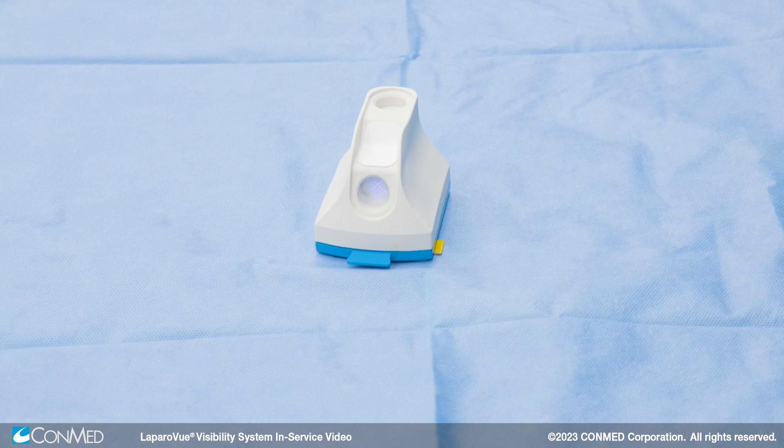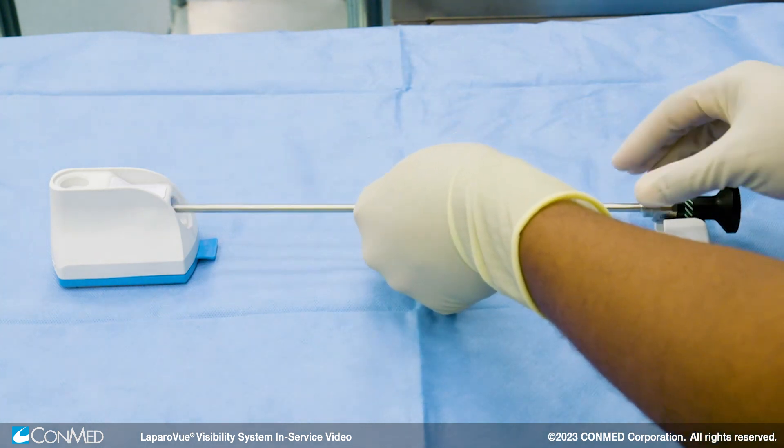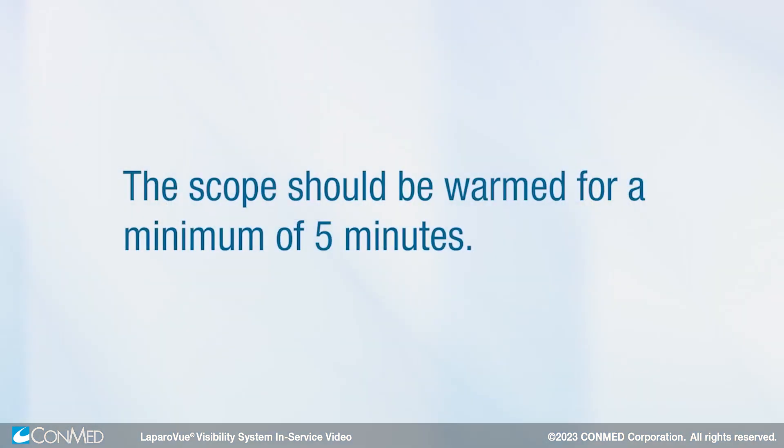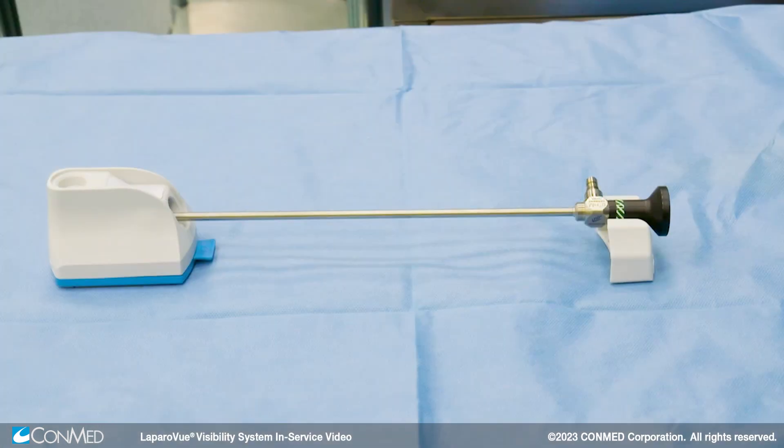Now the device is ready for use on a flat, stable surface. Place the scope in the horizontal port to warm the scope. Use the scope cradle to support the scope and prevent it from rolling off the table. The scope should be warmed for a minimum of 5 minutes.